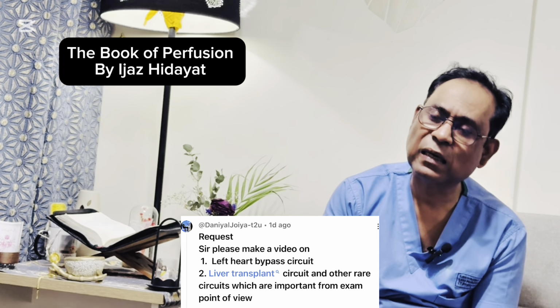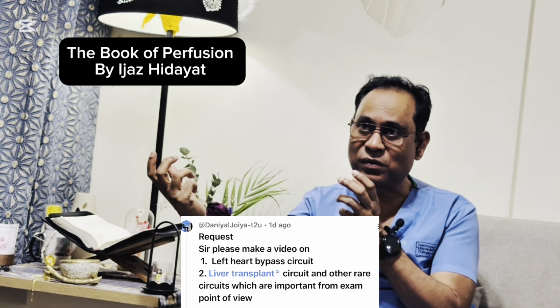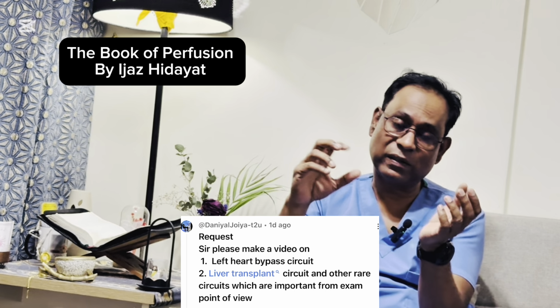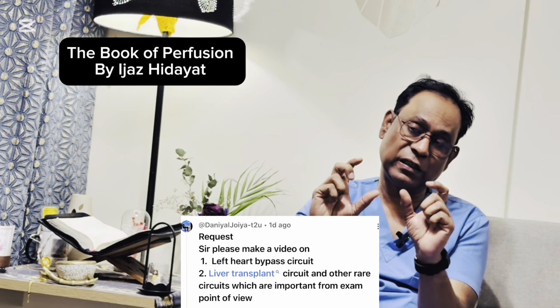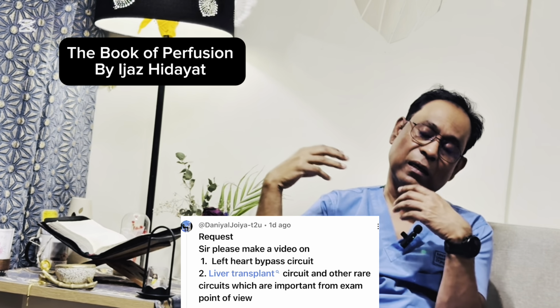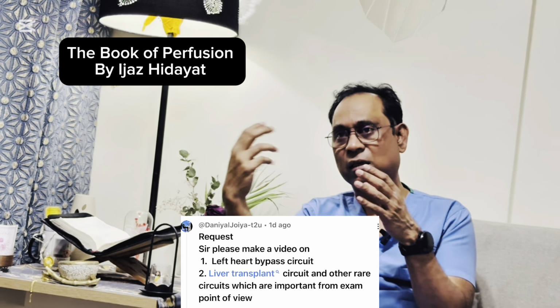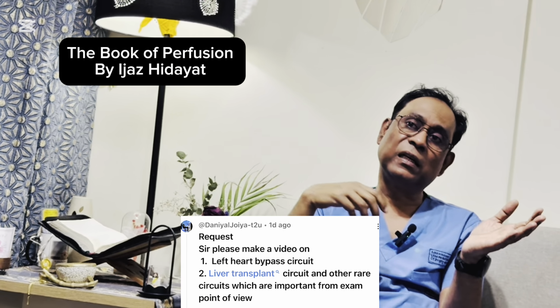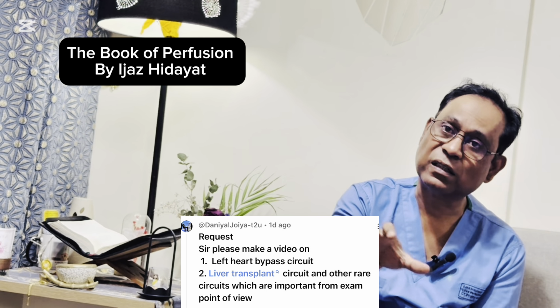In this scenario we are not using roller pumps, we are using a centrifugal pump. In comparison with routine conventional cardiopulmonary bypass, the major difference is that we use a centrifugal pump in left heart bypass, but usually we use the roller pump in cardiopulmonary bypass. In cardiopulmonary bypass we use an oxygenator membrane to oxygenate and ventilate the blood, but here we don't need oxygenation and ventilation because we are already getting oxygenated blood through the lungs, and we are just bypassing the specific area where the surgeon needs to work.